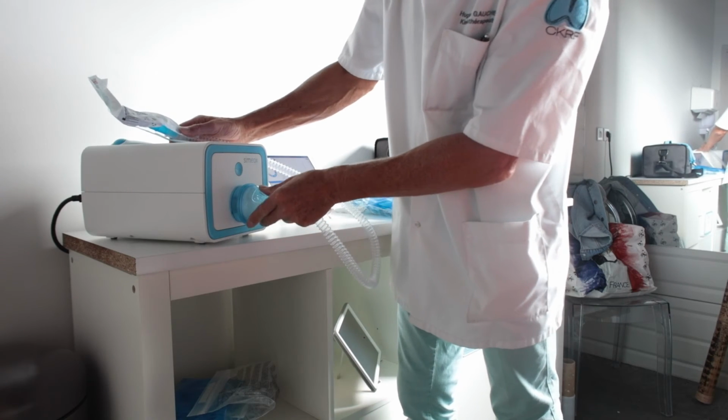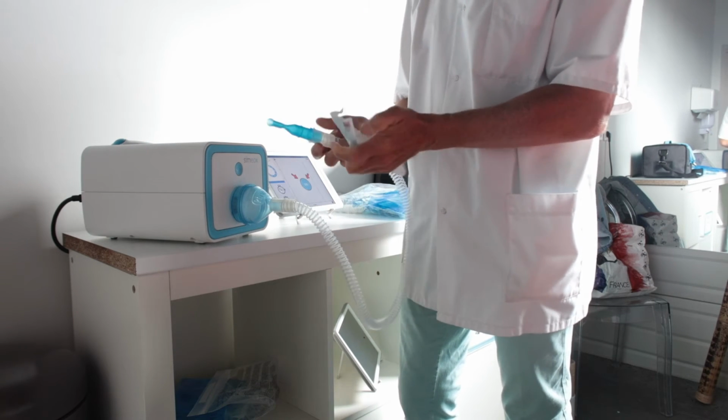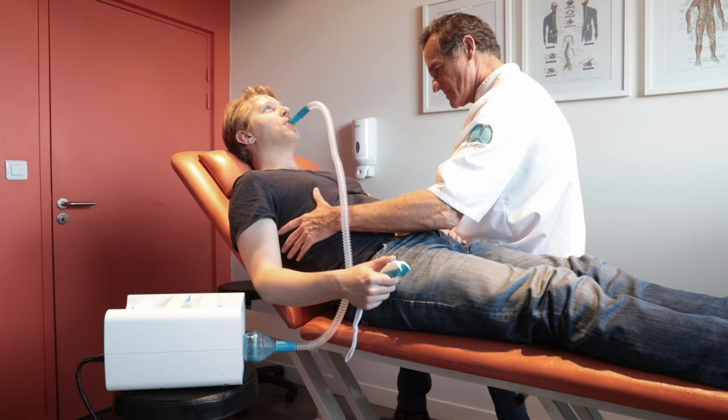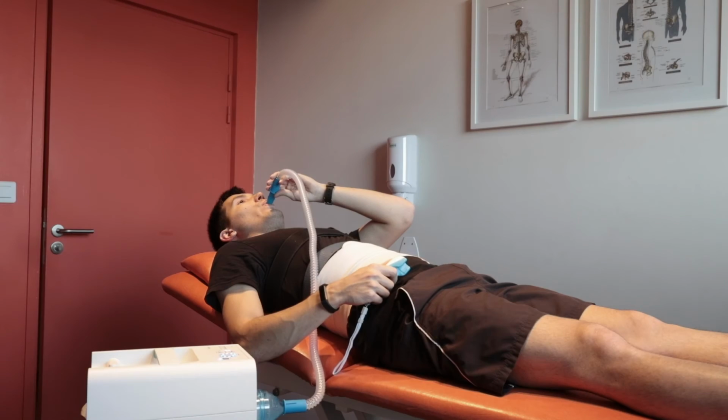The appliance is plugged in. Check the filter and the hygiene of the interface according to the operating instructions. The patient is seated or semi-seated. The right, left dorsal or ventral lateral decubitus positions can also be adopted. The shoulders are relaxed with the head slightly extended.